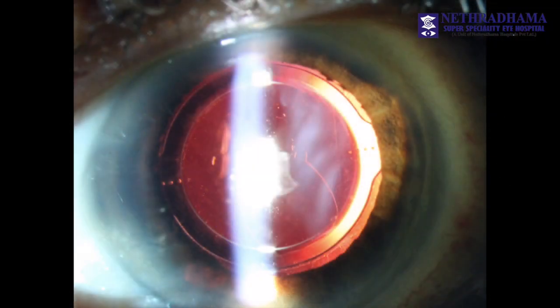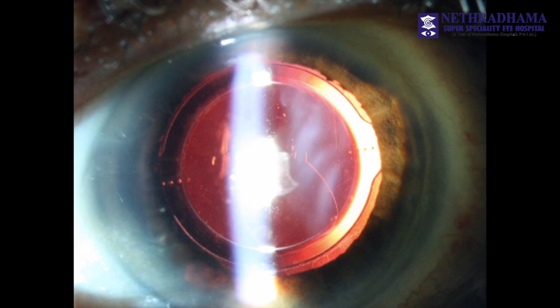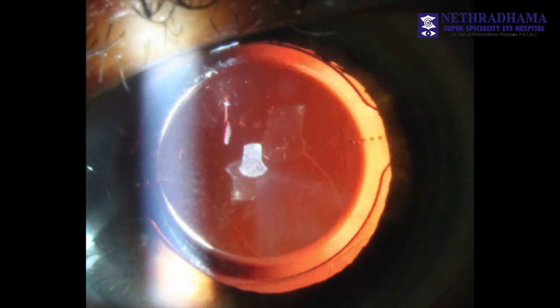This is the first day post-op photograph of this patient. The patient has 6/6 uncorrected vision for distance and you can note that the IOL is very well centered and aligned. The residual refraction is negligible and the patient has a good outcome.